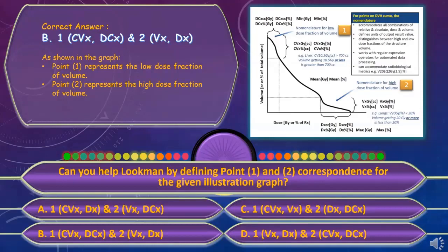And as I said also, it relieves us because we cannot create scripts for each physician, because you will have an endless number of scripts. I mean scripts that grab the DVH and make the analysis and tell you which organ is passing the constraints and which organ is failing, and also the target structures. If you do this, then you will have maybe 100, 200 scripts, which doesn't make any sense. But if you make, let's say, a standard one, everyone will follow. It will relieve you from a lot of pain.